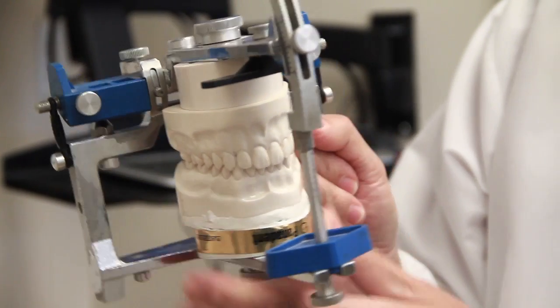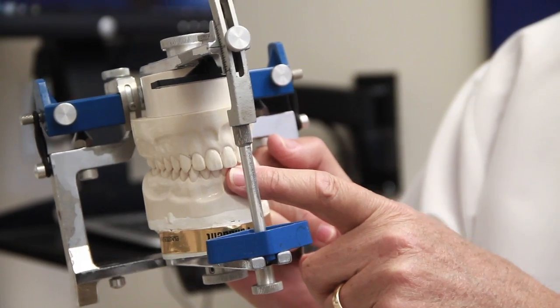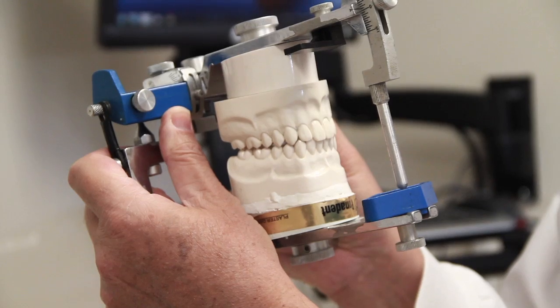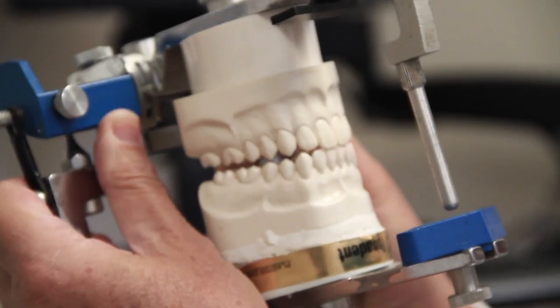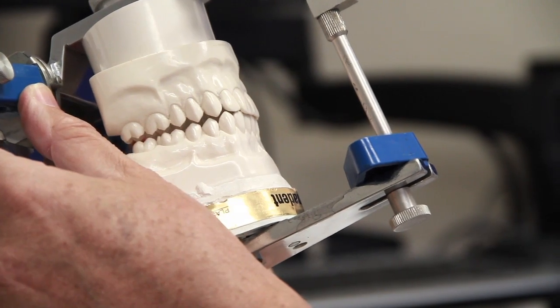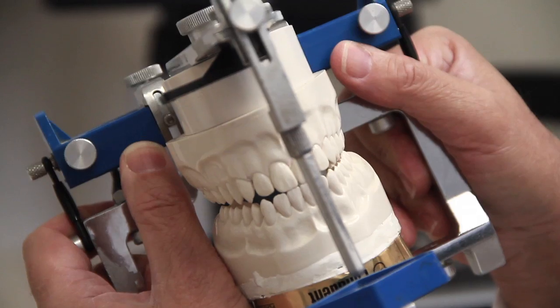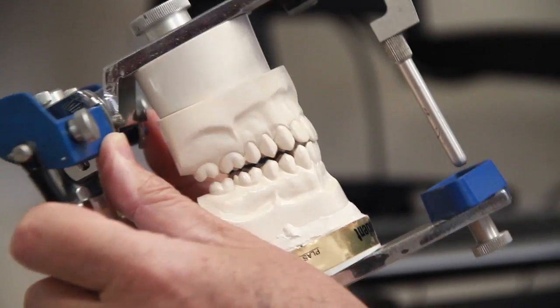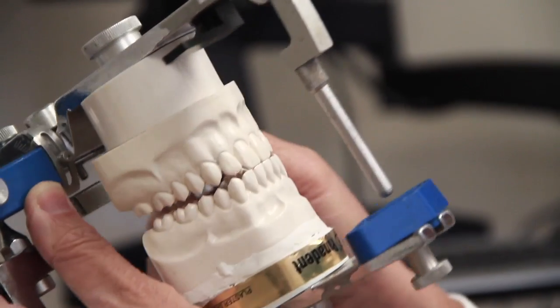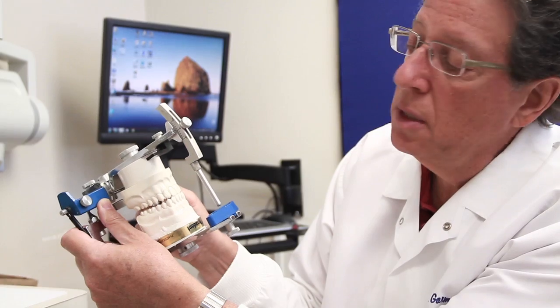Number two, you need to have your anterior determinants — nice overjet, nice overbite — so that when you move the teeth, they immediately disclude in protrusive. And when you're in full edge-to-edge, you can see there's a lot of clearance on each side, so it's impossible for any teeth to wear down in the posterior. The only thing that's going to wear down, if the patient's a grinder, is their front teeth somewhat.